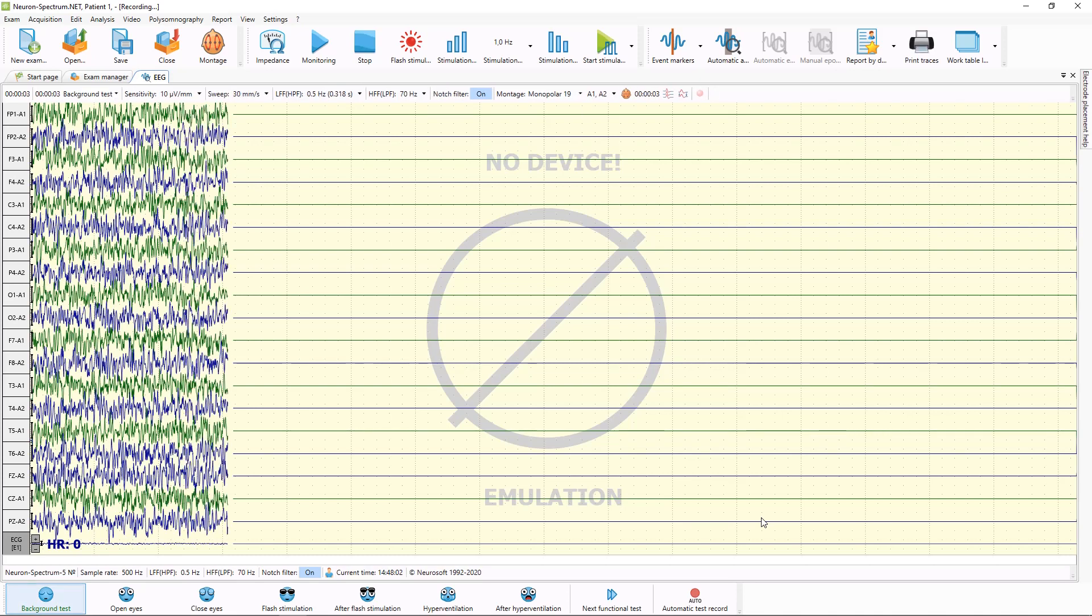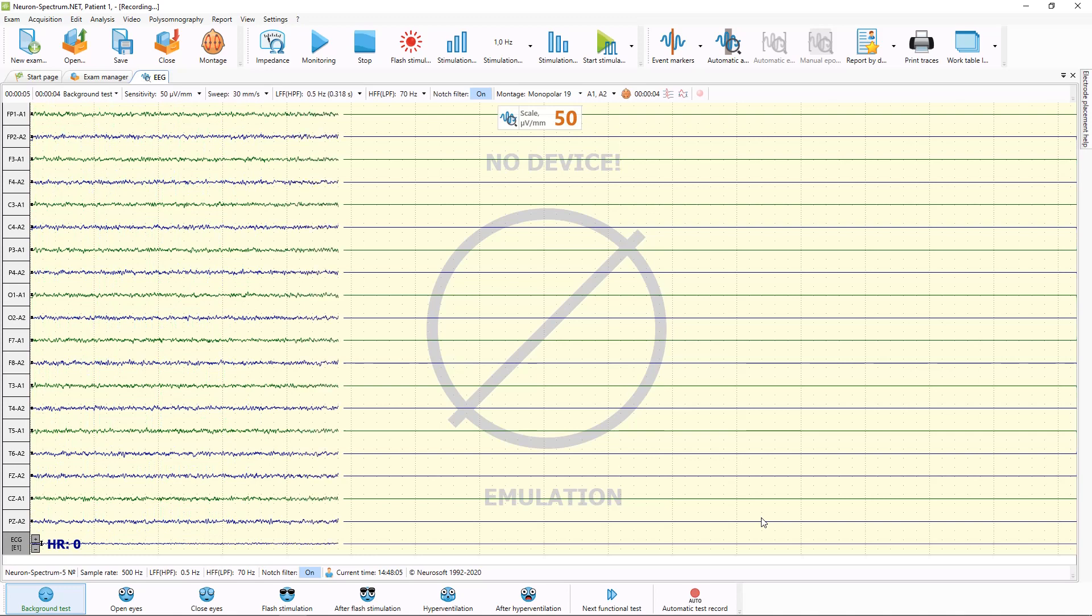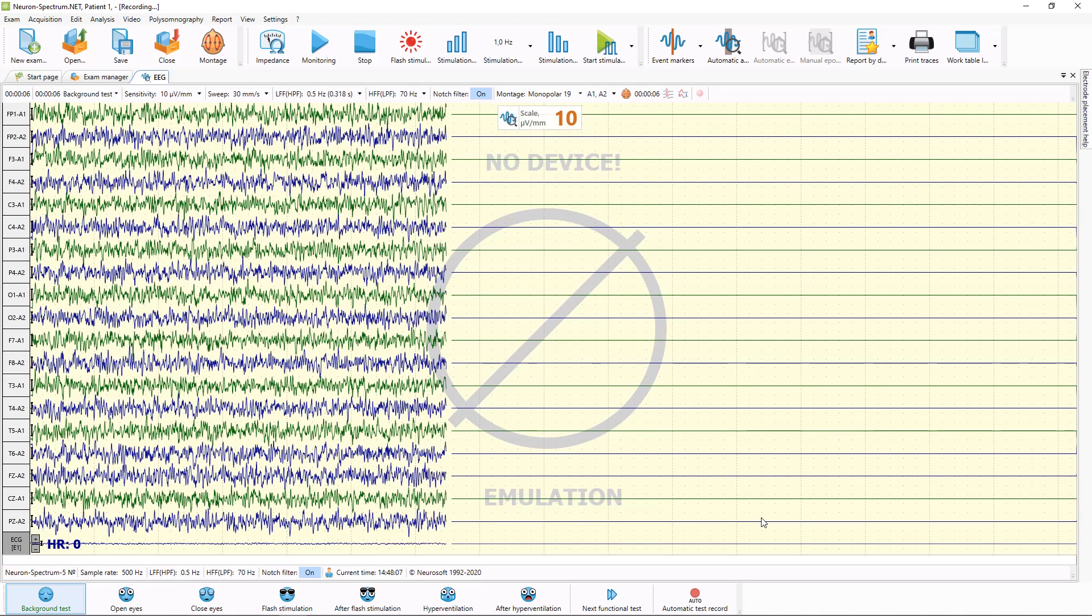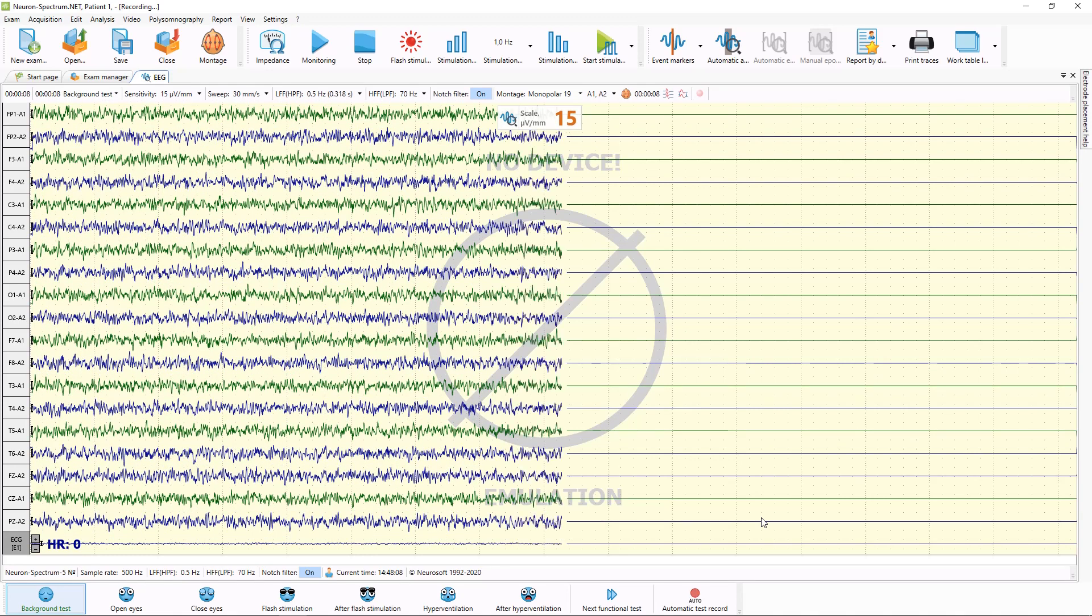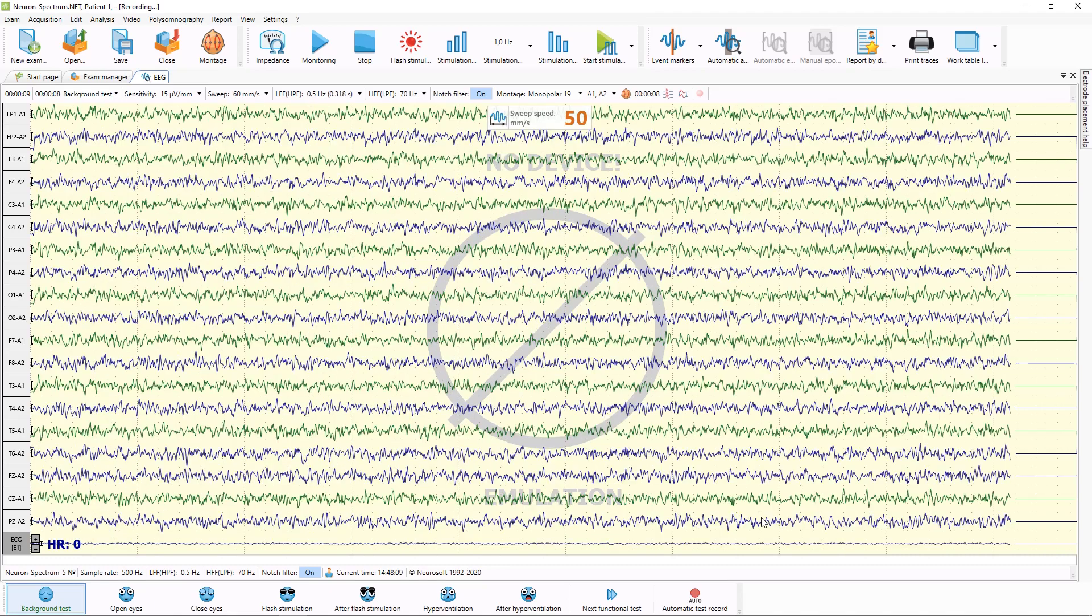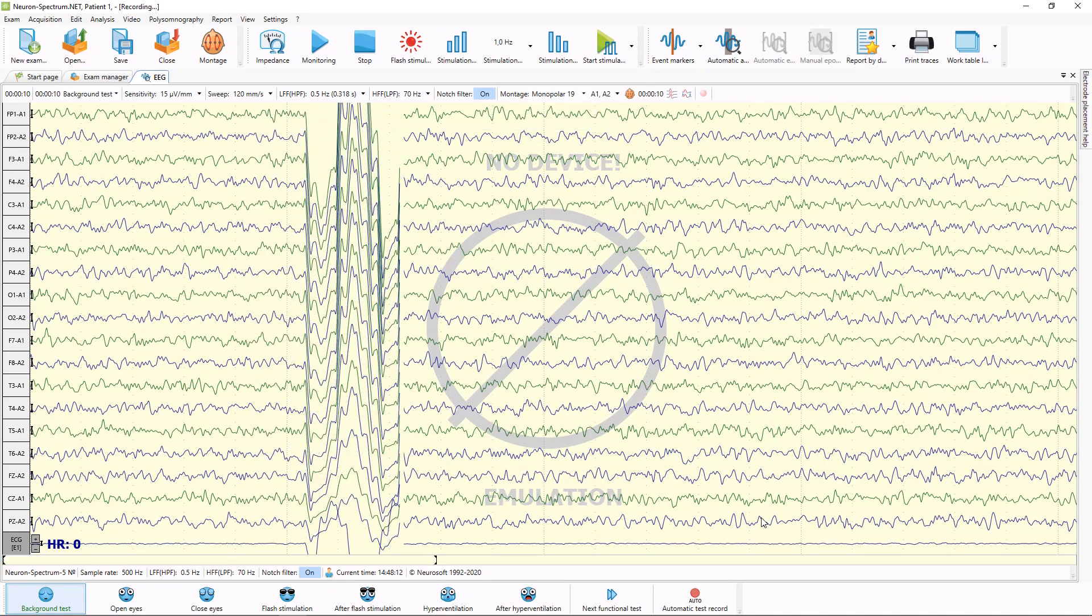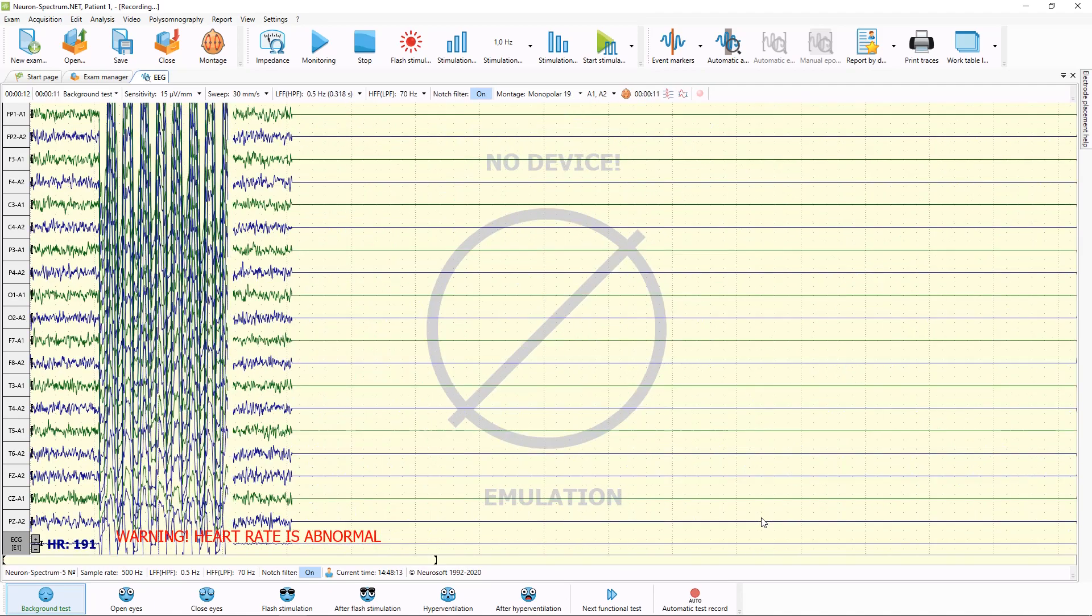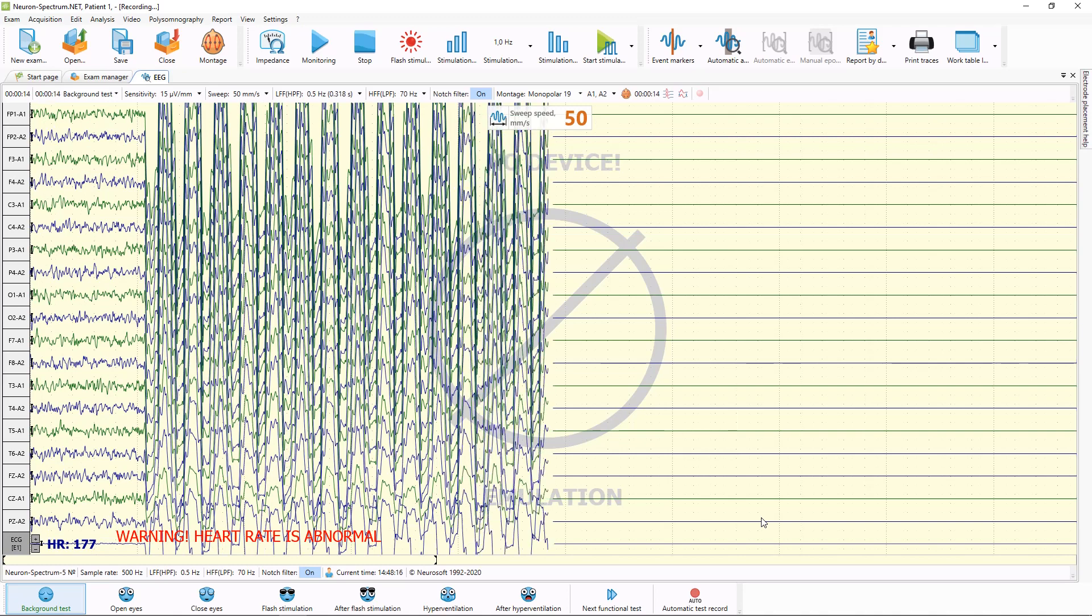With plus and minus keys, you can increase and decrease sensitivity. With multiply and divide buttons, you can decrease and increase sweep speed.